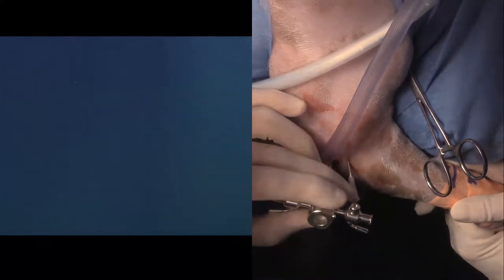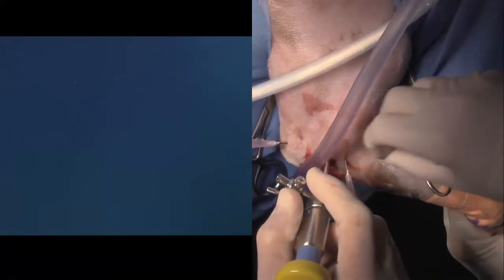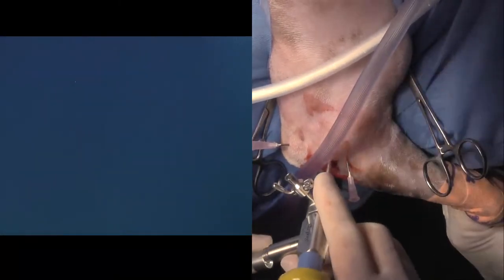So that's one really nice thing about being in a big referral center, that we have doubles of everything. Because if you were in a place that only had one scope of each size, you'd really be in a heap of trouble. Can you just, yeah, that one may just come straight out. Connect the light guide here.